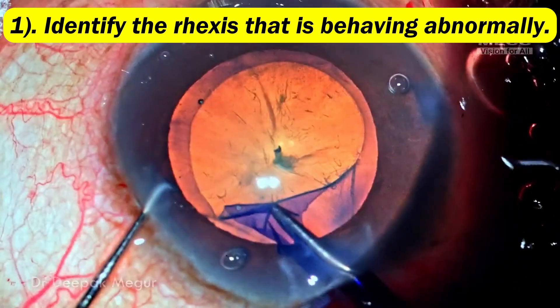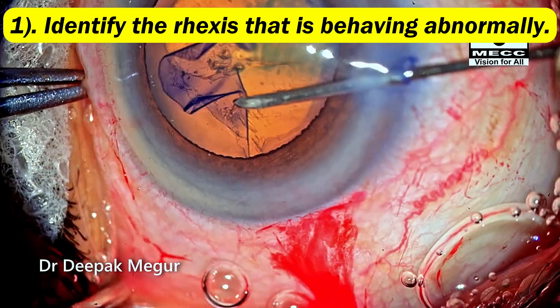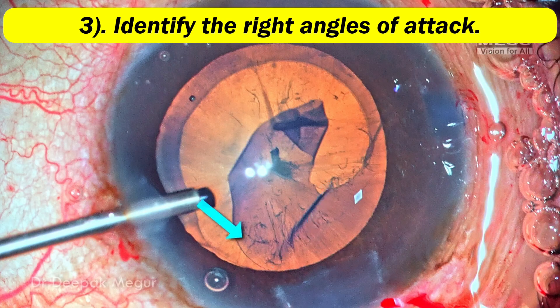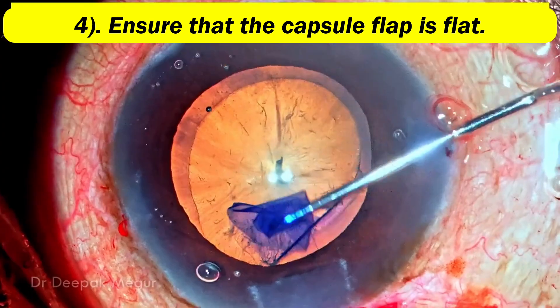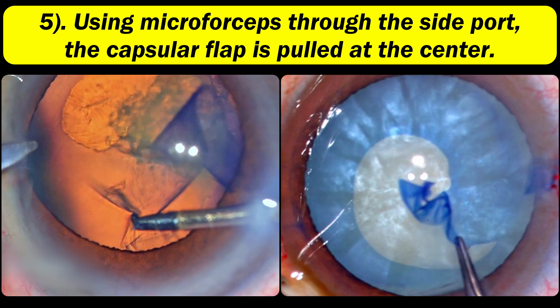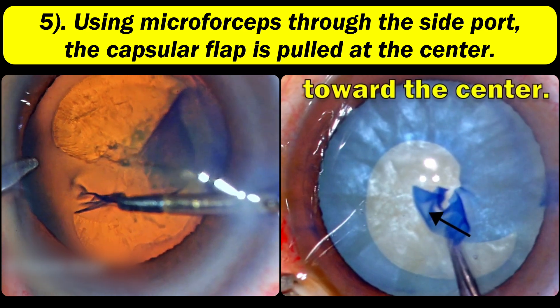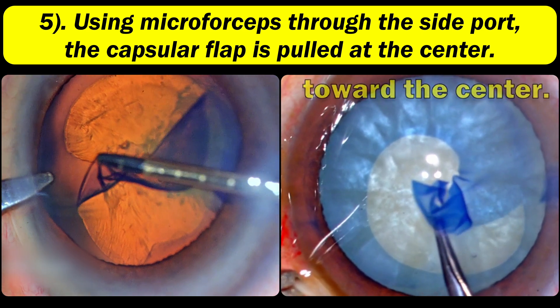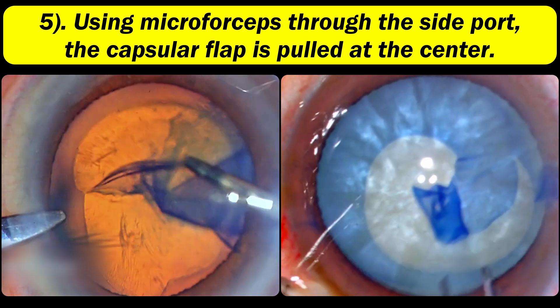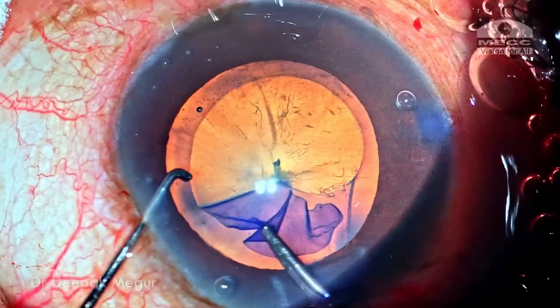These are the steps to follow. Number one: identify that the rhexis is behaving abnormally — identify it early. Number two: refill the chamber with OVD. Number three: identify the right angle of attack. Number four: always ensure the capsule is flat. Then, with the micro forceps or forceps, choose the right angle, lay the capsule flat, and tear it centripetally — the direction should always be towards the center of the pupil. This invariably helps rein in the rhexis that is going away. Let me take you through a few of my old cases and reiterate the same points.